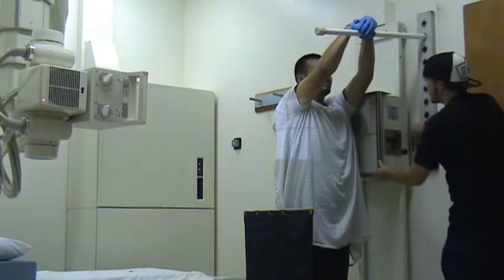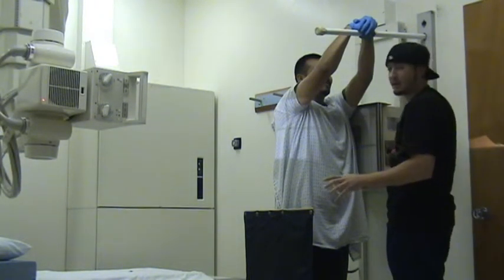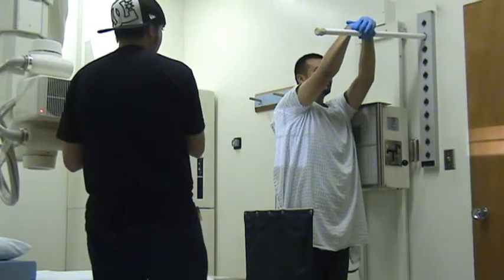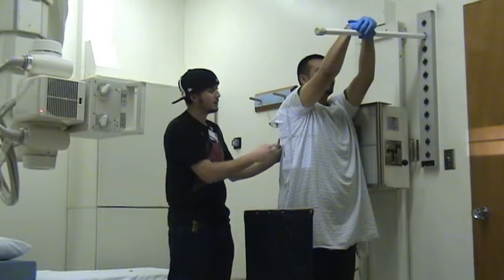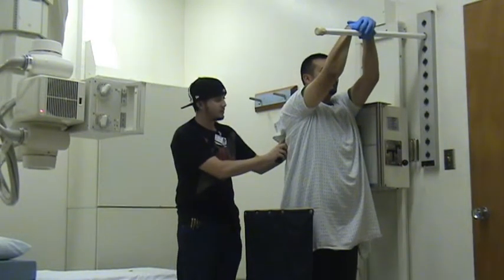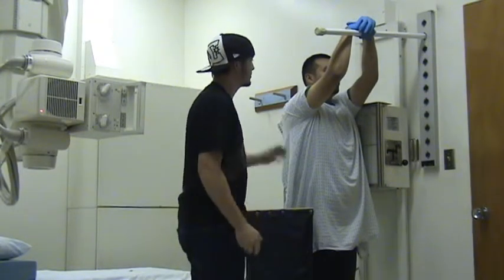And what I like to do is drop the bucky maybe about an inch lower than our PA. Then you want to make sure that your vertical is matching up with your bucky as you lowered the bucky an inch. You want to make sure that crosshair is still at T7. You want a little bit of collimation light behind the patient, and you want to make sure that the patient is not rotated. Just like that, sir. Alright, so he's in lateral view.